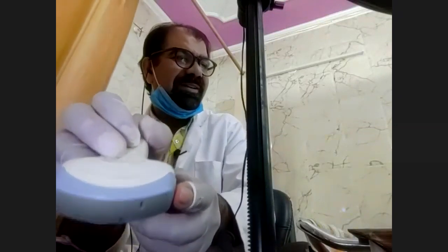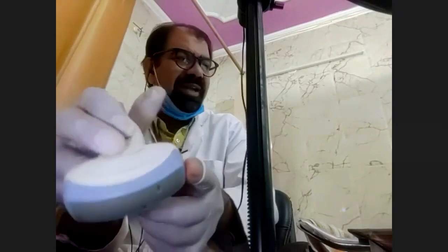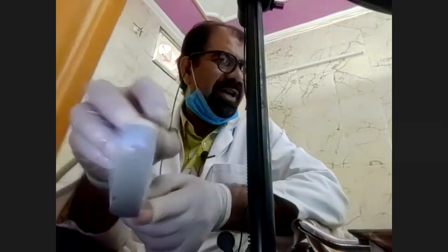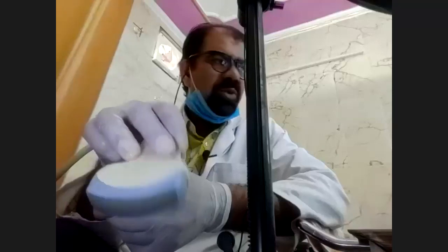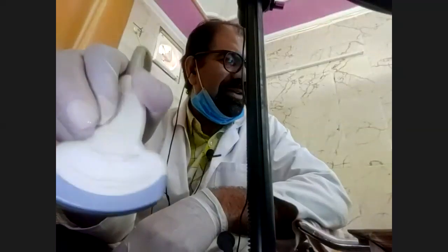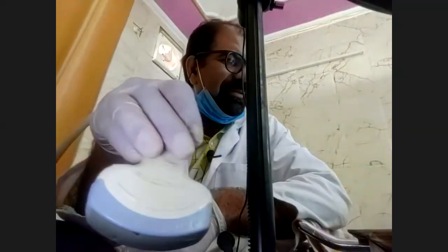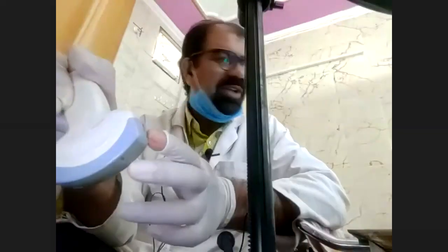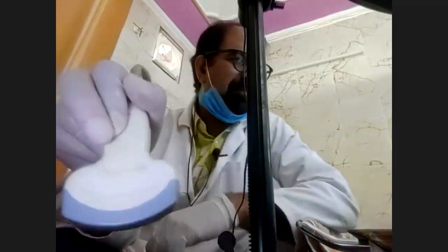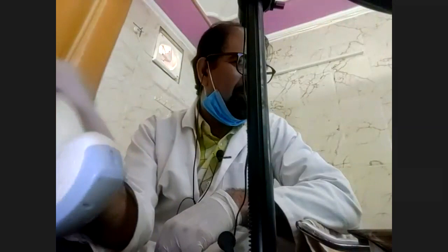It means that the probe position has to be like this, not the other way. So when I put it onto the abdomen, I have to put it like this, not like this. This indicator has to be towards the patient's right side. I have to put the probe like this so that the indicator of the probe will be towards the patient's right. Done?